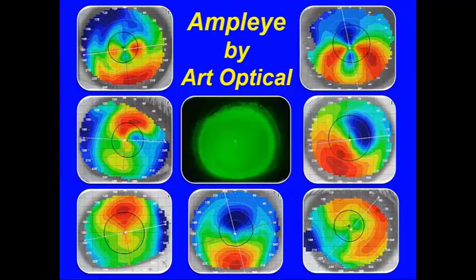The first one that I see here, Patrick, how much change in microns is really required or usually required if the scleral zone is mildly or moderately tight, or if you have some mild or moderate blanching? Yes, if you have some moderate blanching, we do it in degrees, and we do it in 1 degree increments. You noticed in the discussion when we were talking about the peripheral zone, the limbal zone, we raised that up in 5 degree increments. But in the periphery, we just go by 1 step to 5 steps, with 1 step being just a subtle change in the periphery, and that is really very often all that's required.